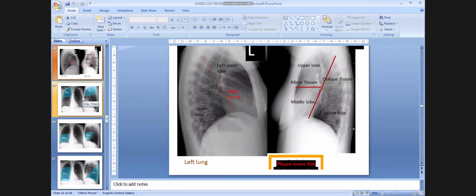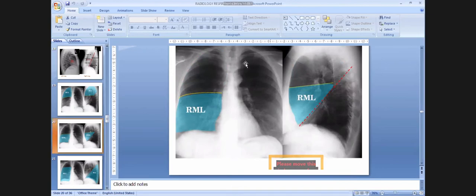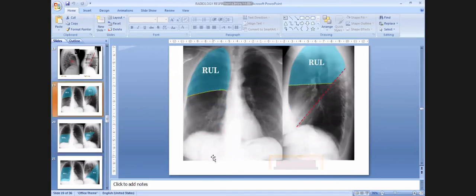So pretty much, doctor, any questions about the lobes are going to refer to the slides after number 18, so 19, 20, 21. The terms for the lobes. Okay. What do you see? I meant, doctor, any questions related to the lobes for both right and left lung are going to be related to the ones with the blue rectangles, like the ones we saw on slides 19, 20 and 21, etc.